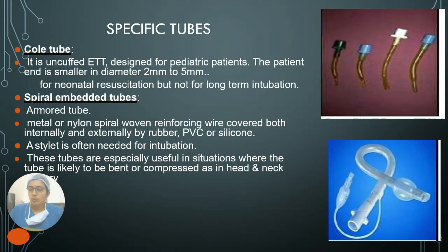Specific tubes. Cole tube. It is an uncuffed ET tube designed for pediatric patients. The patient end is smaller in diameter, 2 to 5 mm, for neonatal resuscitation but not for long-term intubations.